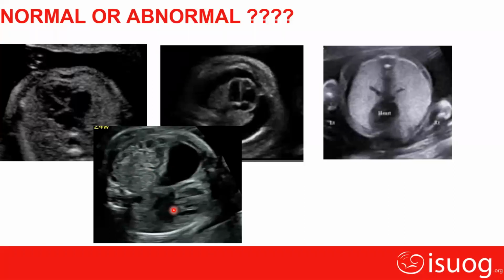But of course, to diagnose CDH, we have to see the fetus in different views. We have to check for the stomach in the abdomen, and we have to see the baby in the sagittal view as well.